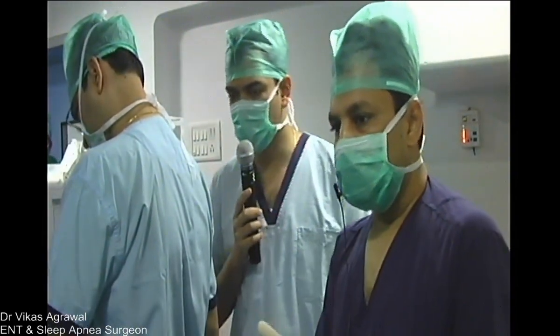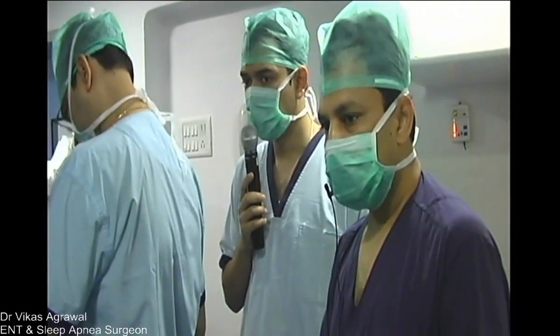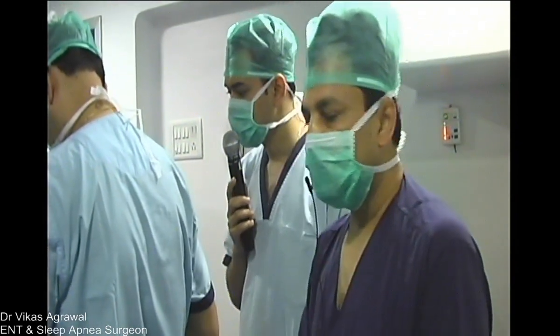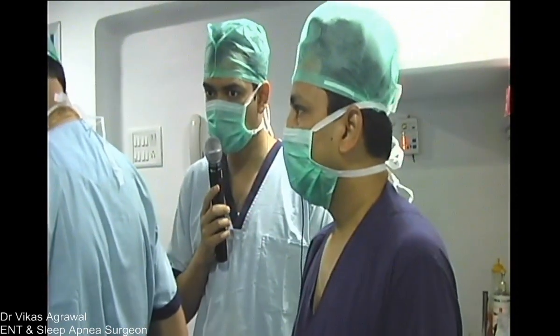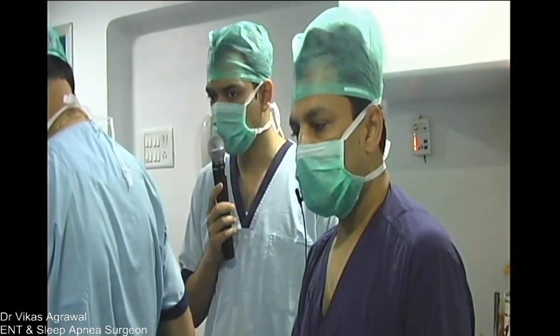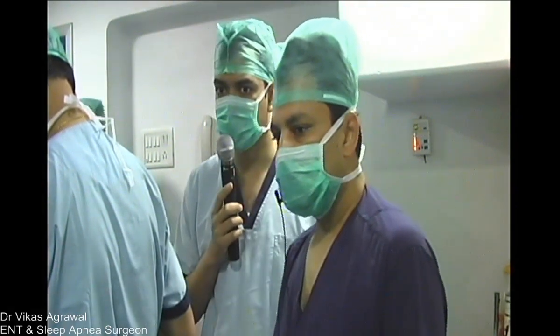But what we can also do is a clinical assessment. If somebody does not have a BIS, that does not mean that he cannot do a drug-induced sleep endoscopy. Absolutely. So, simple clinical measures. Once you are in the OT, there are two things you want to ensure. A, you want to see that the patient is sufficiently sedated. A simple test, just by calling out the patient's name, can tell us whether the patient is sufficiently sedated.